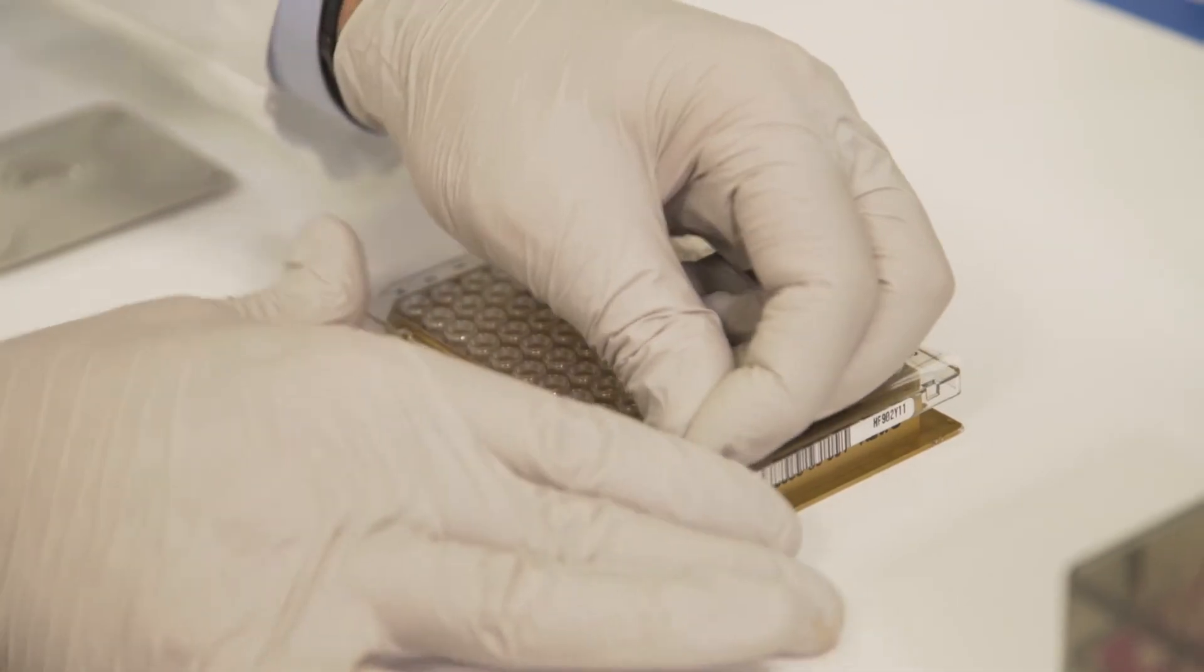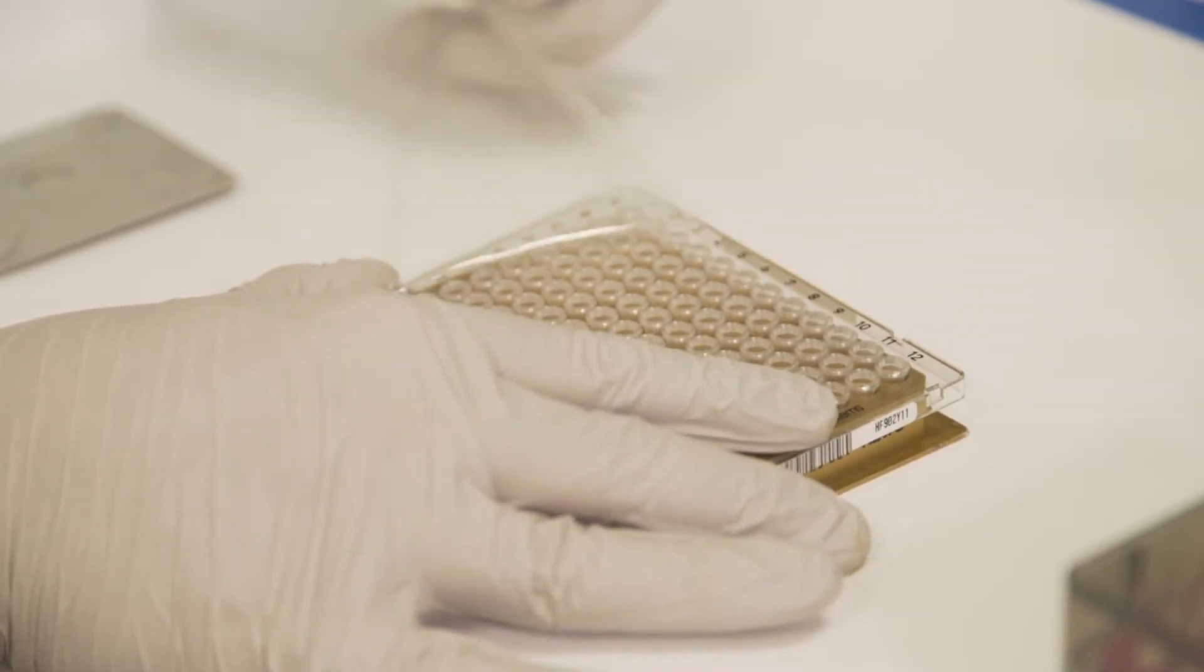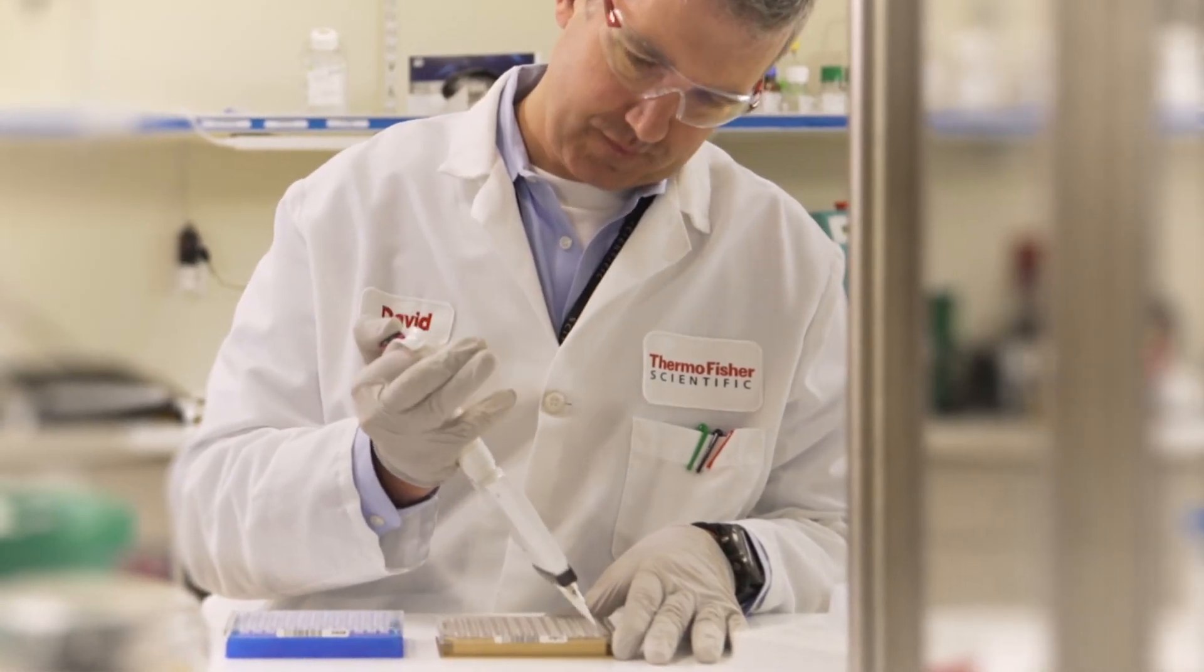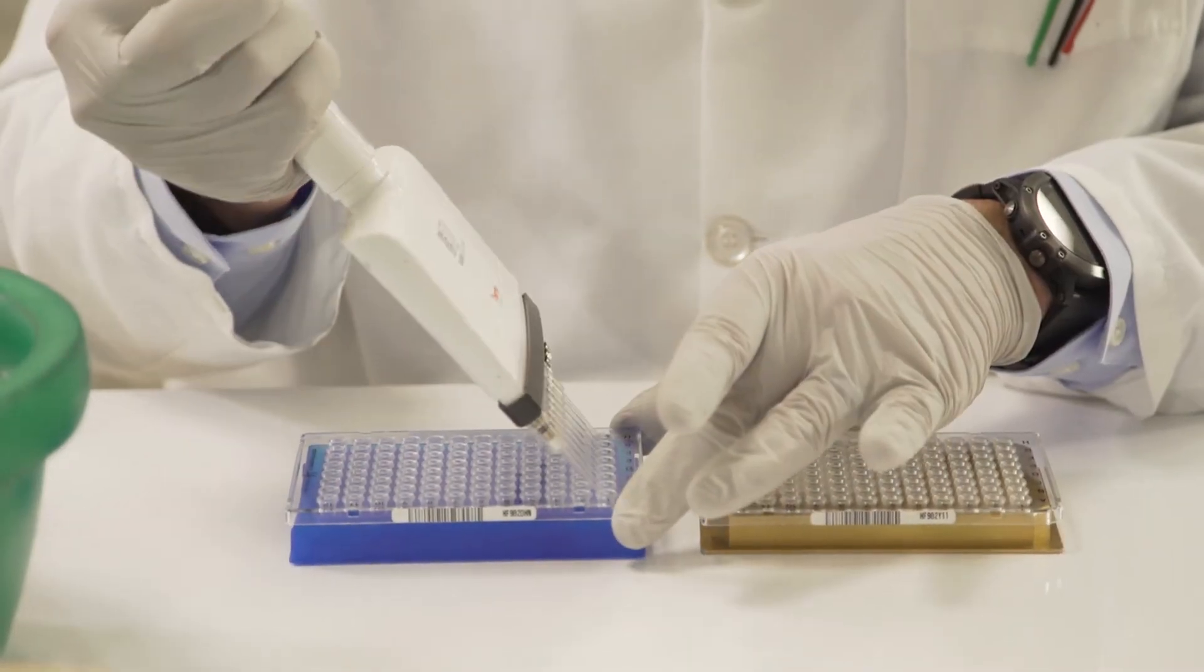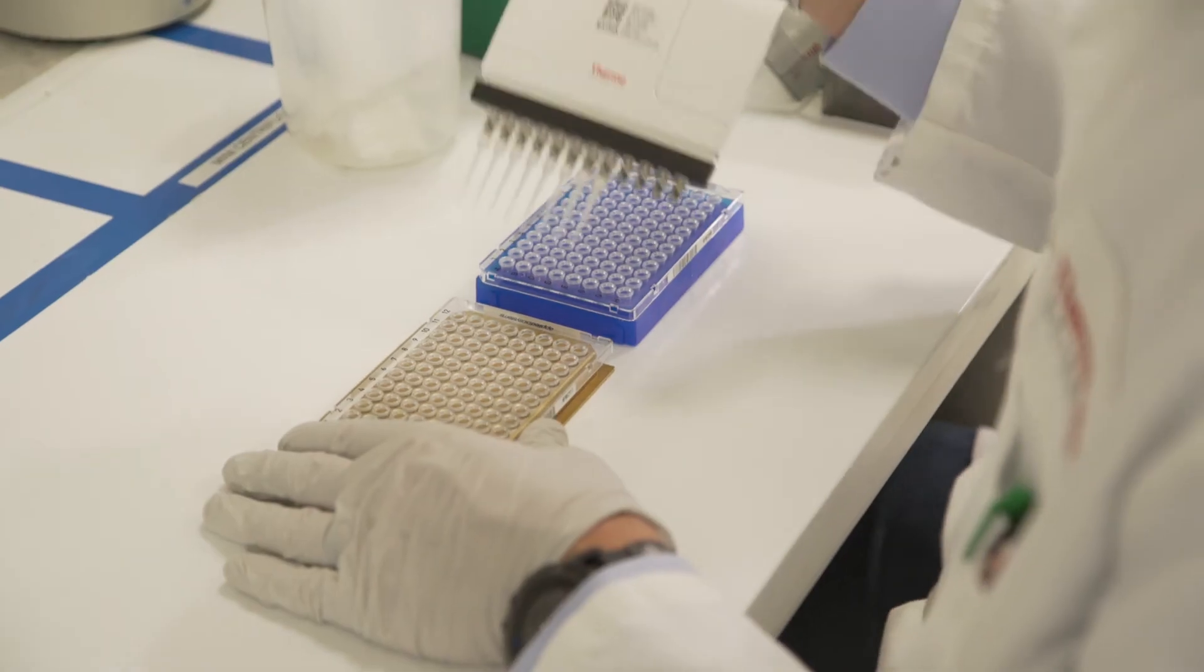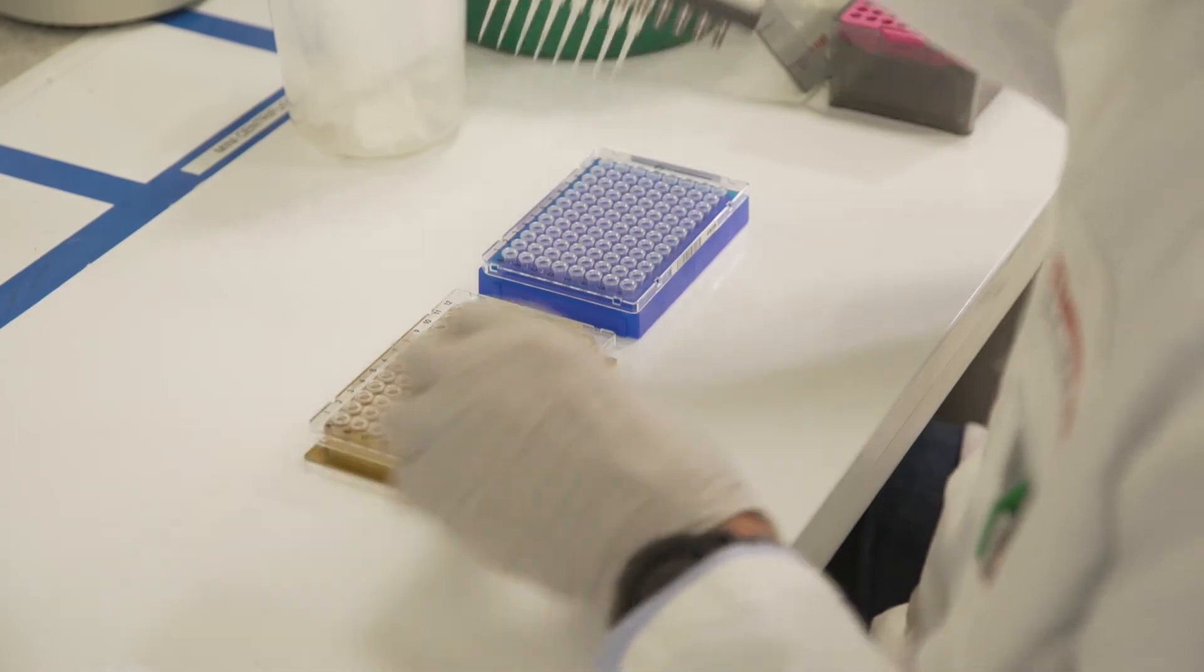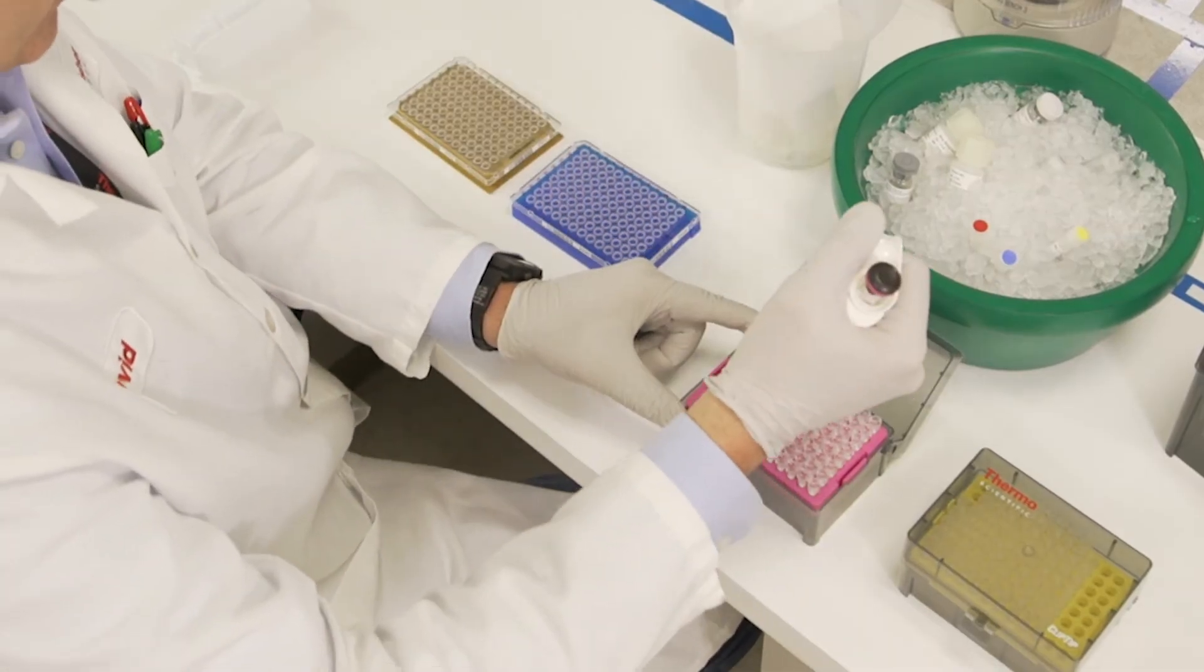You're now ready to transfer the solutions from your working plate to the PCR assay plate. Using a multi-channel pipette, add five microliters of the antibody conjugate mixture to each well. Then add five microliters of either your diluted standard or the samples. Remember to use fresh tips between each transfer.